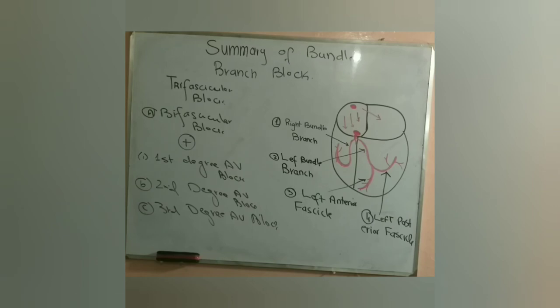So whenever there are videos which require the details of these things, I'll be able to explain everything in detail, but in these videos I just try to give a little bit of an idea so that any doctor can understand what the branches are, how their blocks are picked up from the ECG, and what their initial management is. Otherwise these are very lengthy topics, but I hope this summary gives some idea of it.